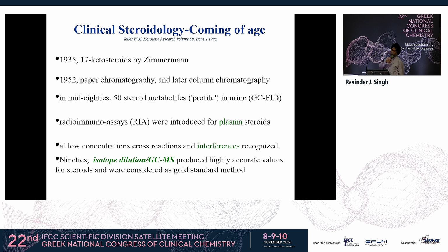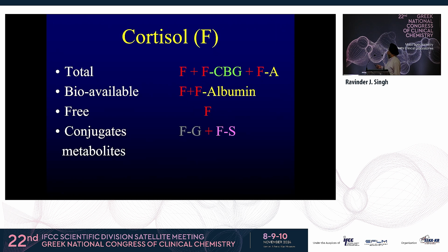As the marathon is going on outside, and you are the founders of the Olympics here, today the immunoassays are not used in confirming doping. That method is still isotope dilution gas chromatography mass spec, GC-MS, because this is the gold standard. So these immunoassays are good, practical, and low cost, but they do not meet the standard of care. Any legal issues, whether it is doping or employment issues, you would have to use the GC-MS assay.